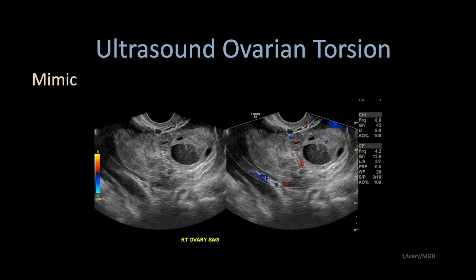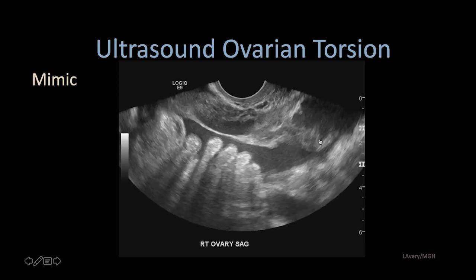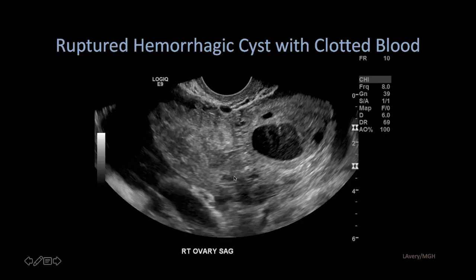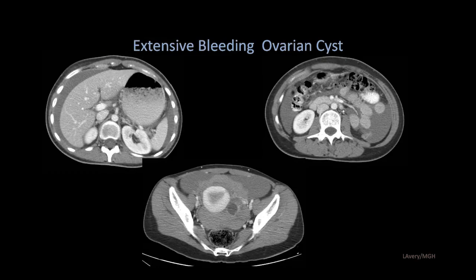Here's a mimic of ovarian torsion. We have a large right adnexal lesion with apparent follicles, but extending into the pelvis we see complex fluid in the cul-de-sac with internal echoes consistent with hemoperitoneum. Looking closer, there aren't actually follicles in this portion of the ovary, and on color blood flow, only part of the ovary shows flow. This is not a torsed ovary — this is a normal-sized ovary with a bleeding hemorrhagic cyst, large volume hemoperitoneum, and a dense heterogeneous blood clot adjacent to the ovary.